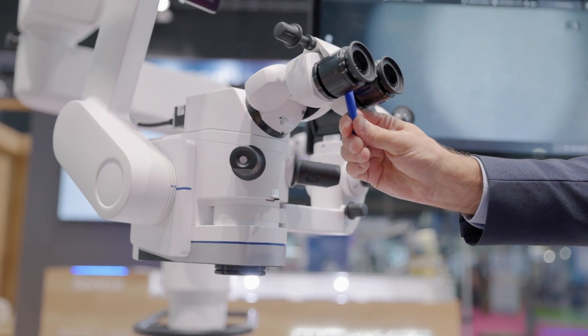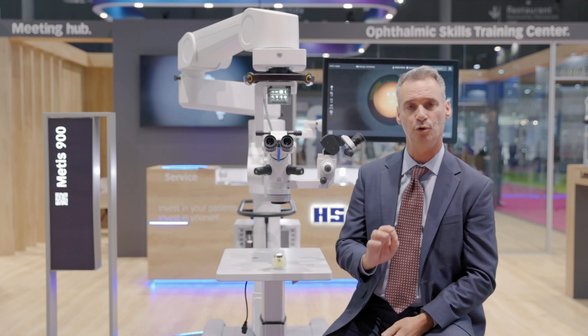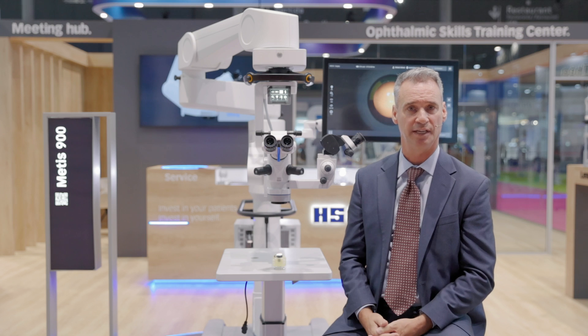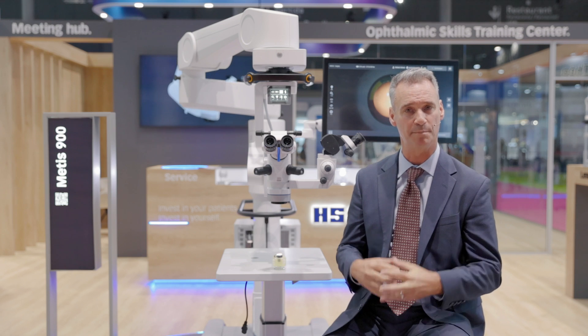they're ready to go and start the glaucoma aspect of the procedure. The new red reflex on the microscope is brilliant and stable, and this is something that the surgeon will really benefit from — with eye movement or other aspects of the surgery where there's movement inside the eye.